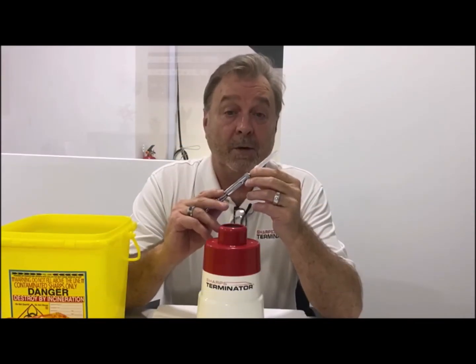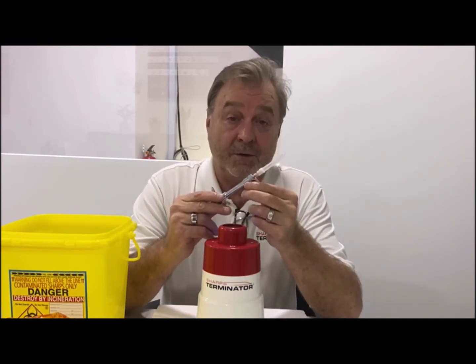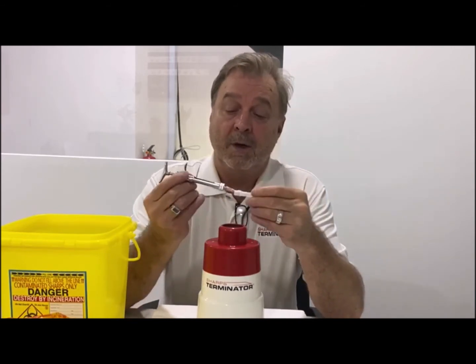The Sharps Terminator will be a very effective tool in the dental industry. Because of the design of the syringe, the dental industry experiences the highest rate of needle stick incidents around the world.